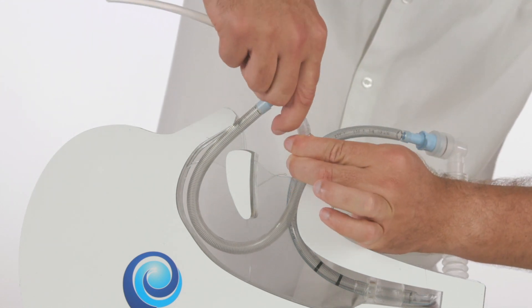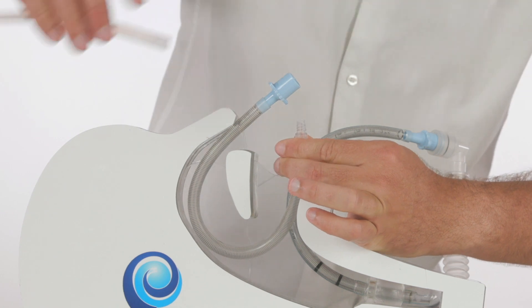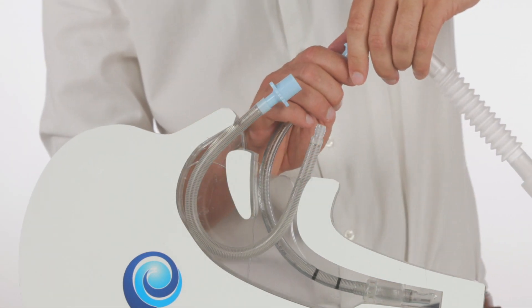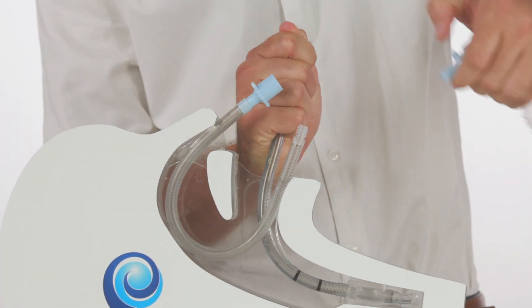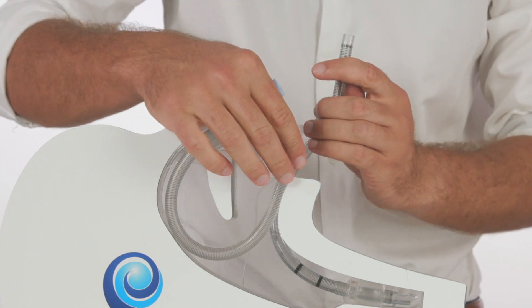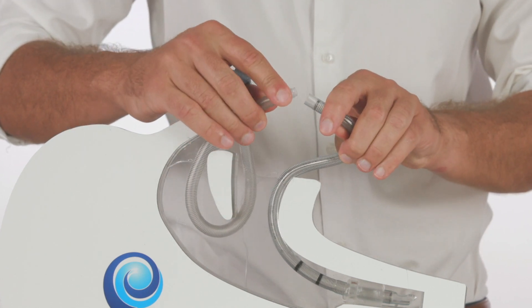At this point, we are then able to remove the introducer with a gentle twist. The anaesthetic circuit is then also removed from the ETT, taking with it the 15mm connector, and the ETT is joined to the airway tubing.